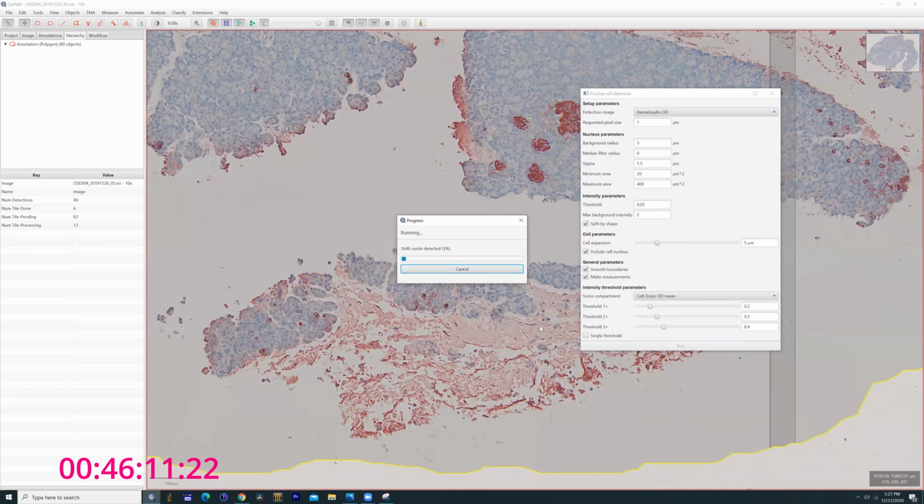And so it may help distinguish the hematoxylin stained sections, may help distinguish the islets from this connective tissue. It is also labeled with the secondary. But I'm afraid it also might compromise the counts inside the islets. So it's a trade-off. And there's certainly room to play with the parameters and refine.